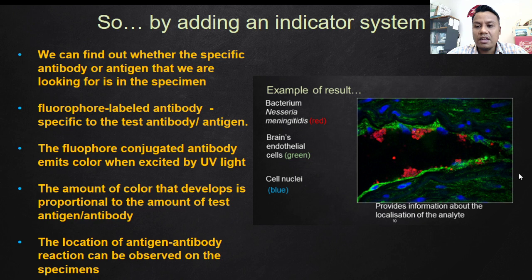So this is the brain tissue. So three different fluorophore labeled antibody. So for immunofluorescence, we can have multiple colors. Doesn't have to be only one. So for one test we can use three different specific antibody. Means we can look for three different antigen in one test, and it can be more, 5, 10.